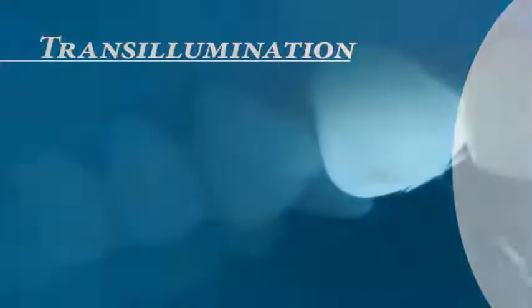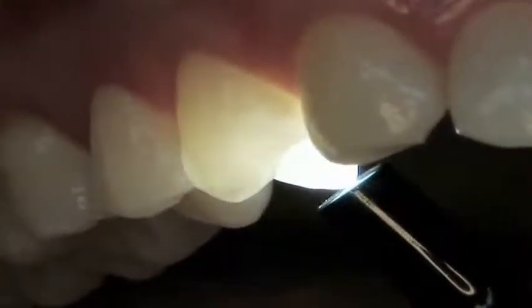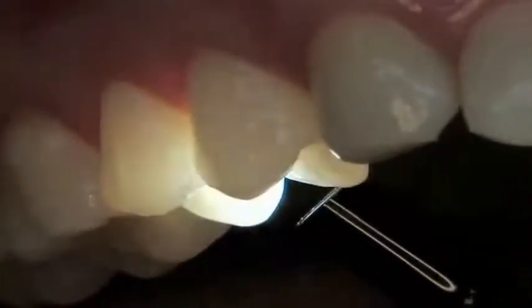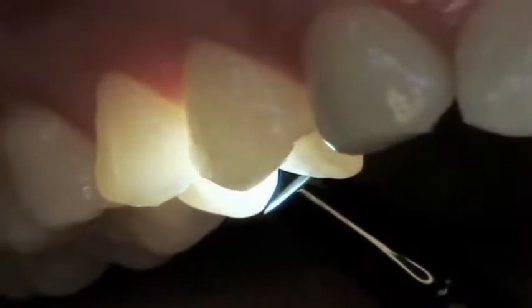Transillumination. Transillumination helps to identify elusive longitudinal crown fractures and infractions. Place the fiber-optic light from various angles and different distances to the suspected tooth or teeth. Transillumination produces contrasting vertical dark and light segments of the tooth at the fracture site.